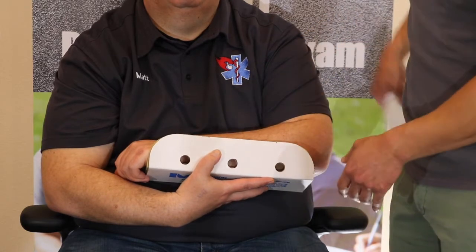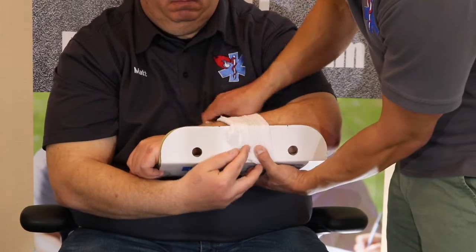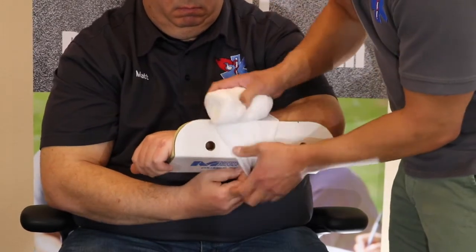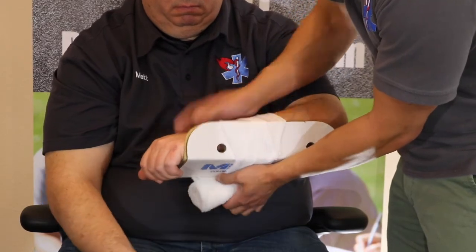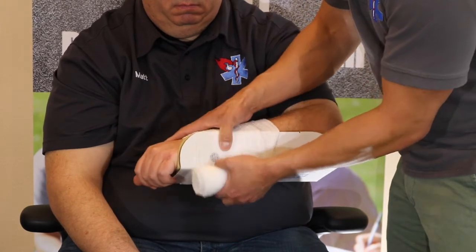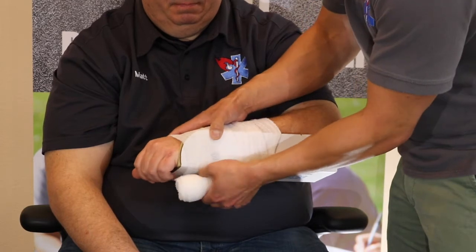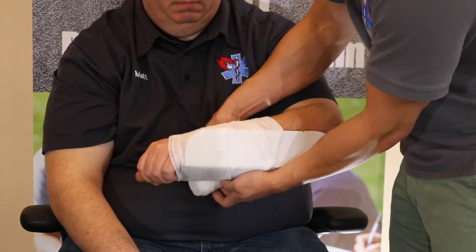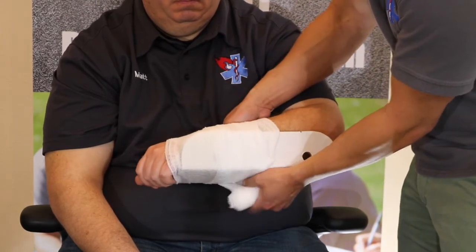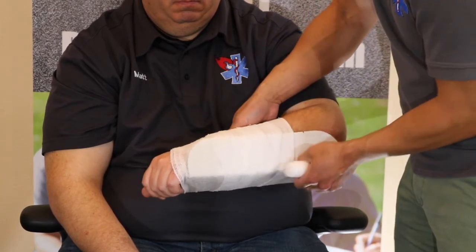You can still attach cardboard splints using the same roll of Curlix. However, this splint is just a little short for the arm, so it's probably not going to achieve the goal of securing one joint above and one joint below the injury. In that case, you may need to do something else, like placing the patient into a sling or swath to also secure the elbow.